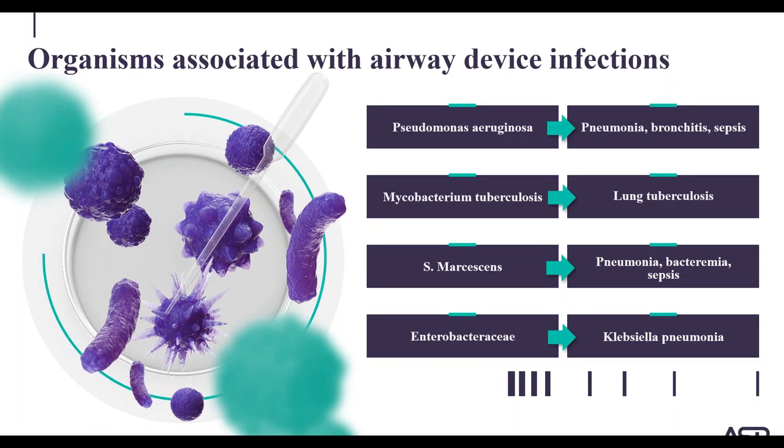An example of an endogenous infection is Pseudomonas aeruginosa resulting from aspiration of secretions in a sedated patient during a flexible bronchoscope. An example of an exogenous, preventable infection during bronchoscopy is Pseudomonas and Mycobacteria being transmitted from one patient to another by a contaminated endoscope or its accessories.